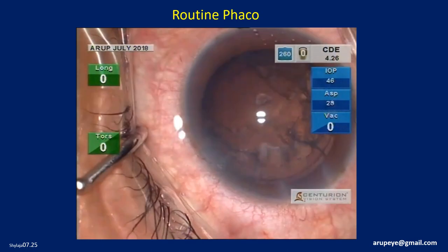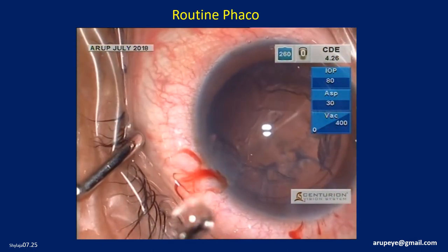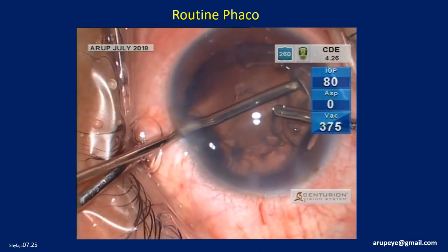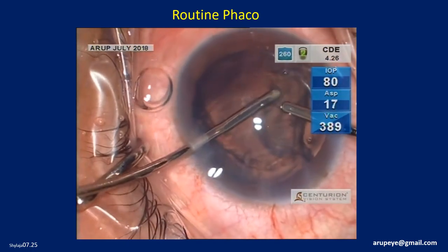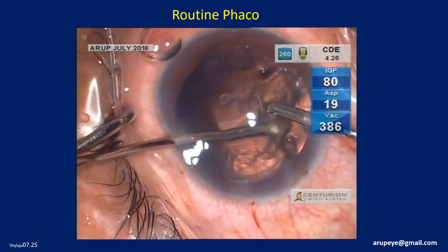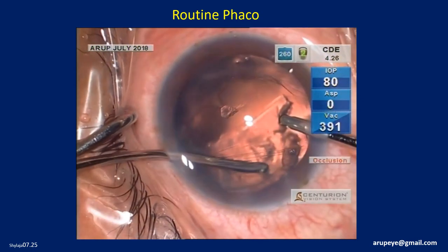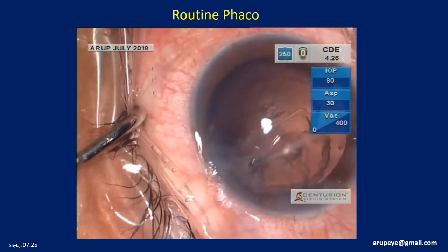The residual lens matter will be removed using the bimanual irrigation-aspiration approach. It is a much more controlled and safer technique. The handpieces can be switched, thereby giving 360-degree access to all portions of the capsular bag.